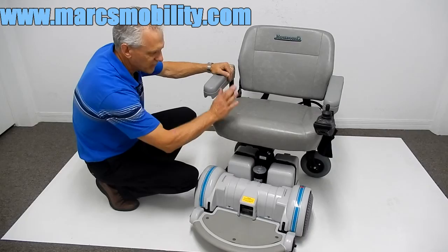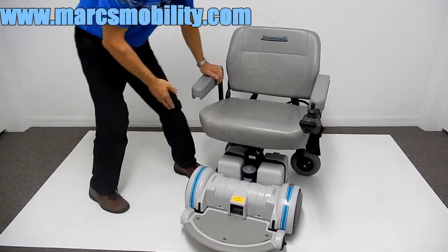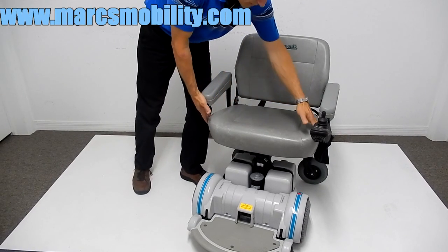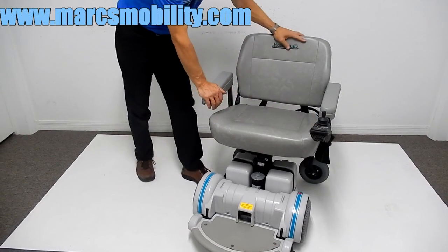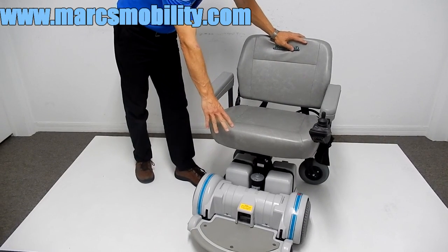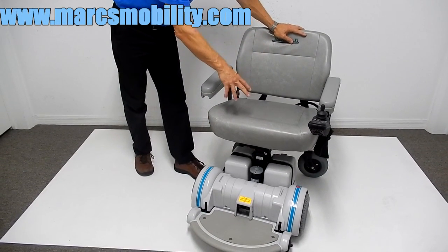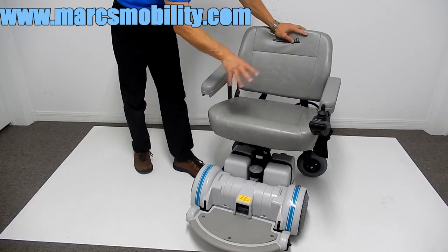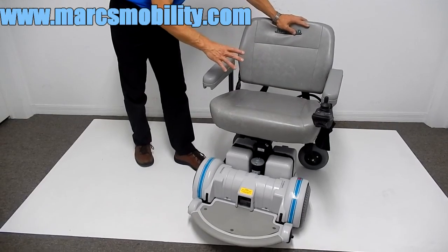The seat on this power chair is extra-large — 23 inches wide by 17 to 18 inches deep. If this seat is too large and you need this chair because of the seat lift, we can switch this seat to a standard 19 by 19 seat, a little bit smaller. So we can change the seat around.